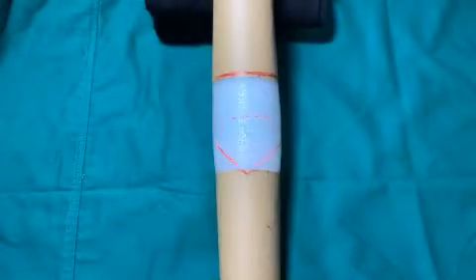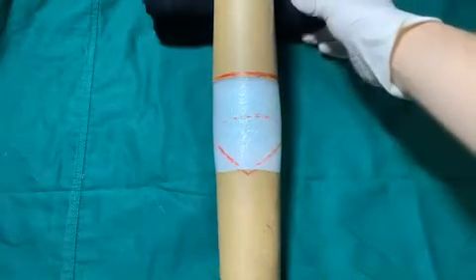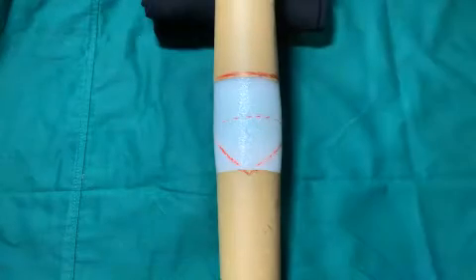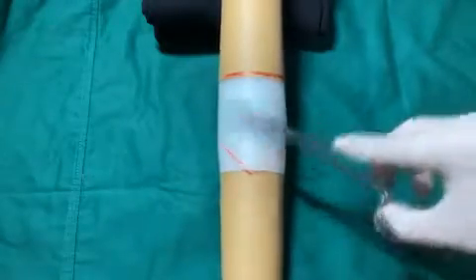Tracheostomy is best done in the operating room with good lighting, instrumentation, suction, diathermy, and assistance. Place the patient in a supine position with the neck extended by a pillow or a bag placed under the shoulders. This is done to deliver the trachea out of the thorax and to give adequate access to the cervical trachea. Sterilize the skin of the anterior neck and the chest.